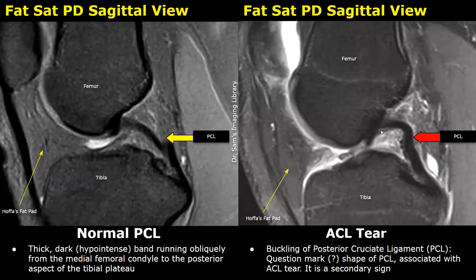In the image on the right, an ACL tear was noted. We can see the difference in the shape of the PCL — it has a question mark shape. This is also called buckling of the posterior cruciate ligament, and it was associated with the ACL tear. It is a secondary sign.